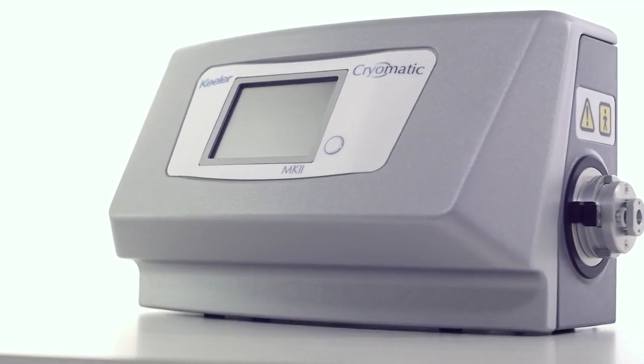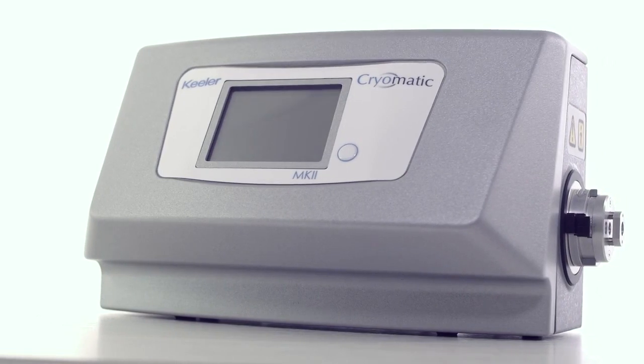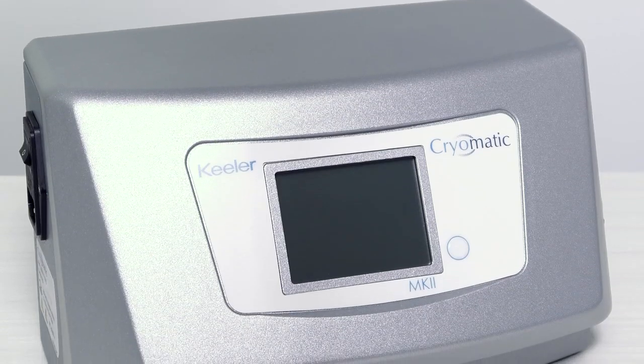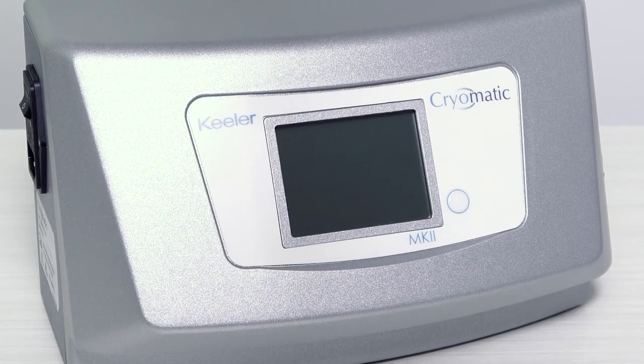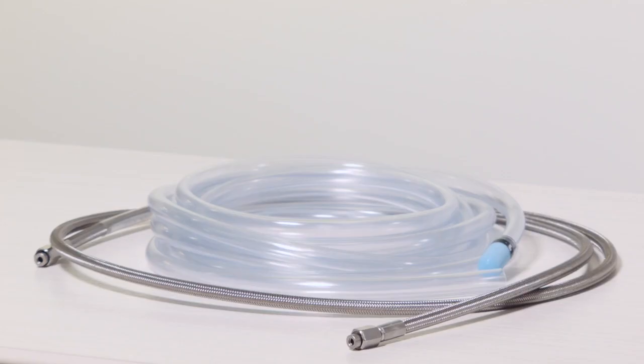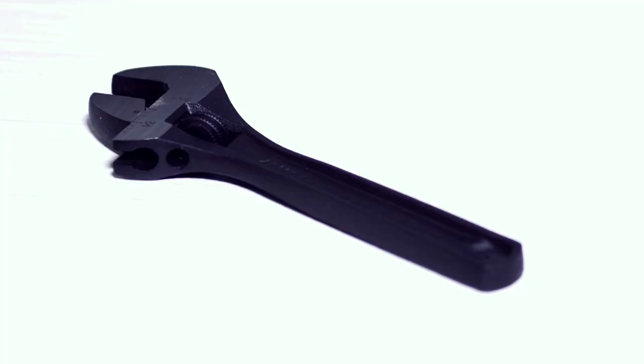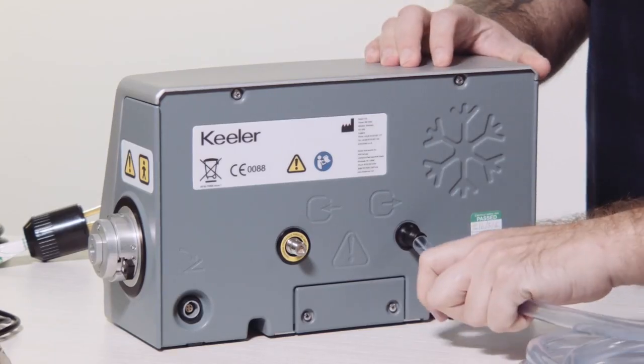This video will outline the procedure for installing and setting up a Keeler cryo system. The Cryomatic system consists of the console, the probes, the foot switch, the mains cord, the high-pressure gas hose, the exhaust hose, and an adjustable wrench. Start by installing the exhaust hose.